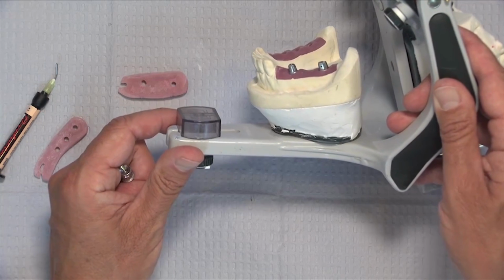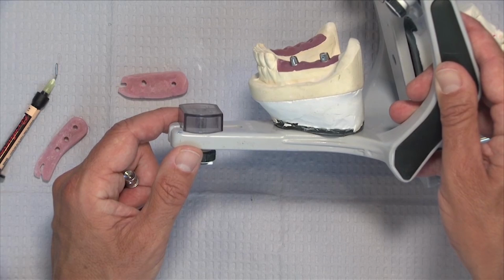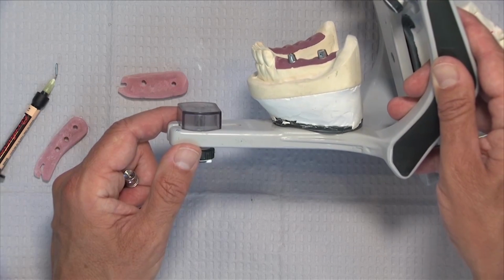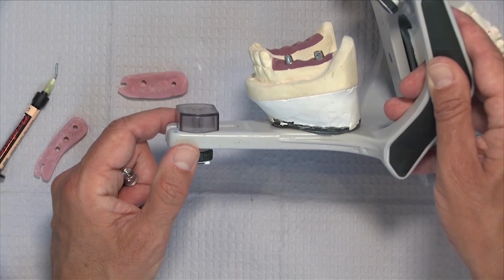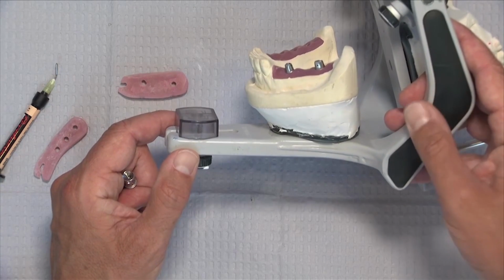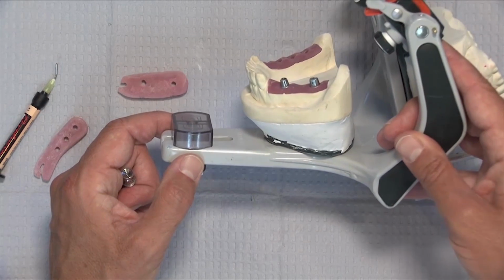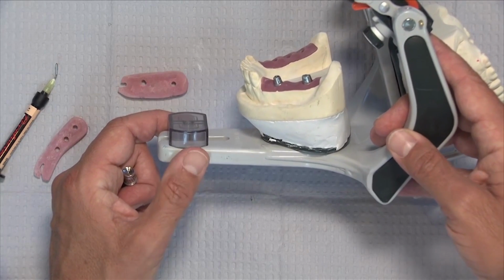Always got to make sure that we get, and this is one of the great reasons to have digital radiography, to be able to take a quick picture and just make sure that these implant components are in fact seated all the way. A lot of times we're dealing with stuff where it might be 3, 4, 5 millimeters subgingival, and visually you just can't check. And you also can't assume that because the screw stopped turning that everything is seated all the way.